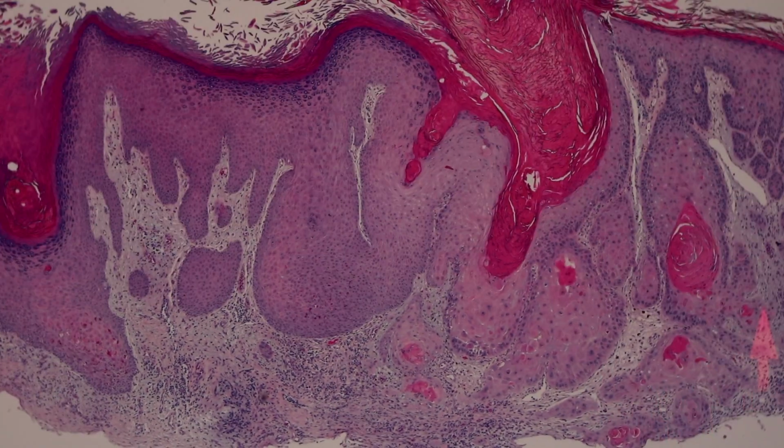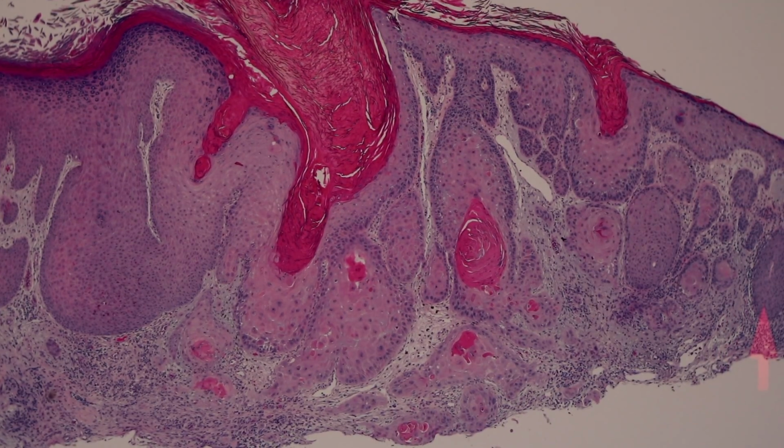I see this multiple times every single day. So we can only do what we can as pathologists. We can only comment on what's available on the slide. But if I have concerns and there's some atypia there, this is the kind of time where I add a comment that I can't see the base of the lesion. And if the lesion persists or recurs, then a repeat biopsy may be indicated. Just to let my colleagues in derm know, hey, keep an eye on this lesion.